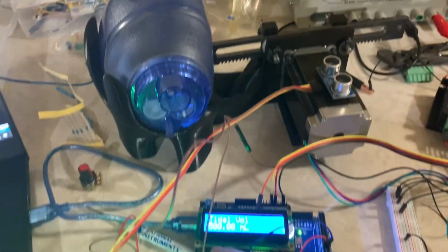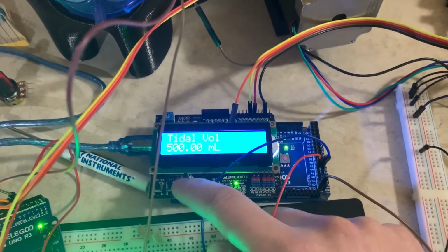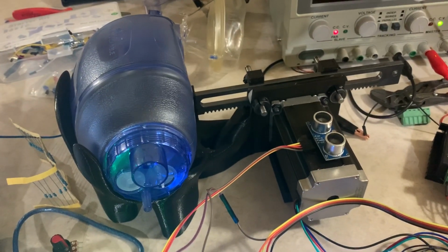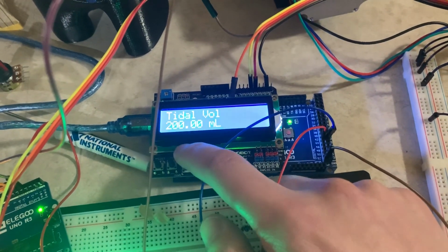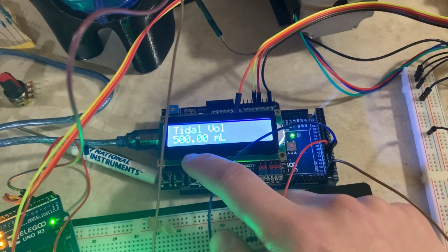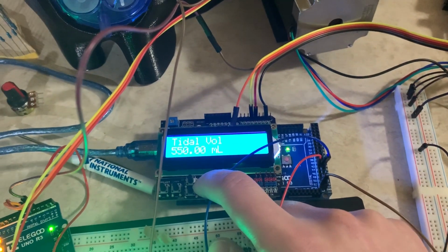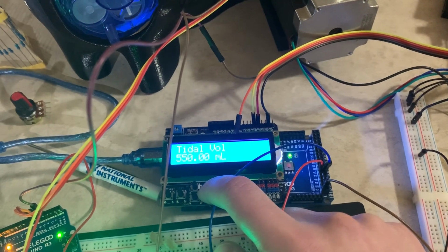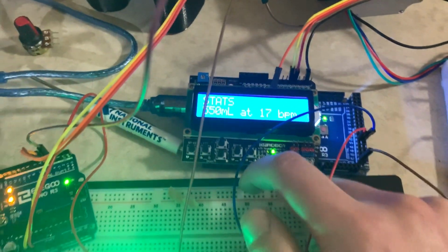And the tidal volume, so the amount it compresses the bag, is also adjustable. So we can see that if we decrease from 500 milliliters down to 200, it's barely compressing at all. And those aren't accurate values, those are just based on a couple volumetric measurements. You can see the stats shown on the main screen here.